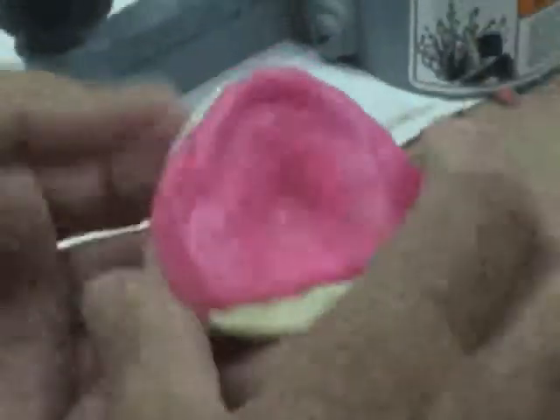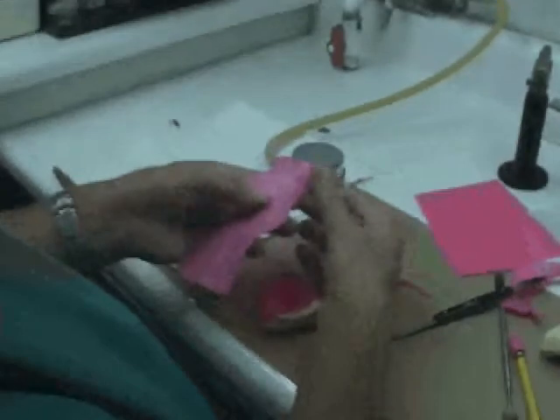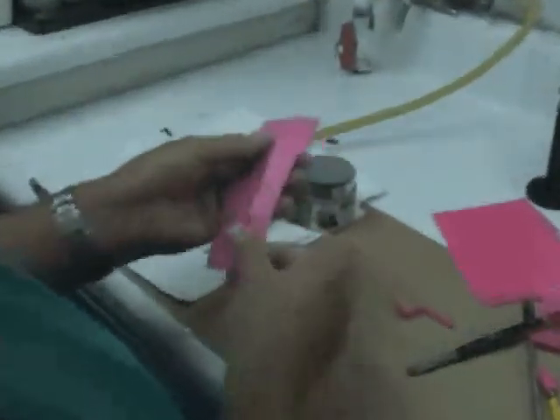Okay, that's the first wax that we apply to this model, and then the second wax sheet we're going to warm up, and then this is going to be folded in thirds. Okay, now we've got it warmed up. See how nice and pliable it is. We're just going to fold it over in thirds.